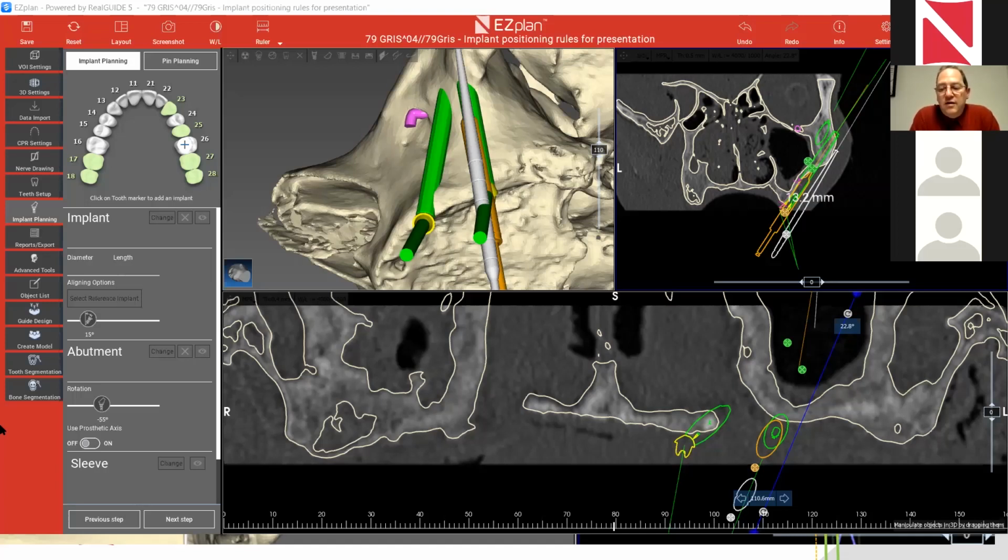And one of the things that could happen is because we perforate the sinus, we can have some sinusitis problem, even though from the literature, the problems of sinusitis are around 3-4% with zygomatic implants and without. So it's not really an issue.